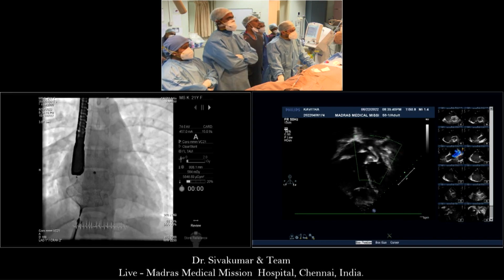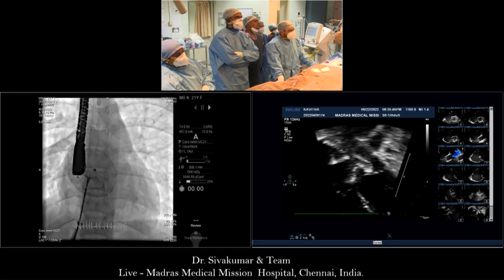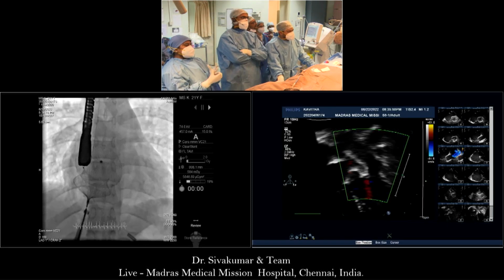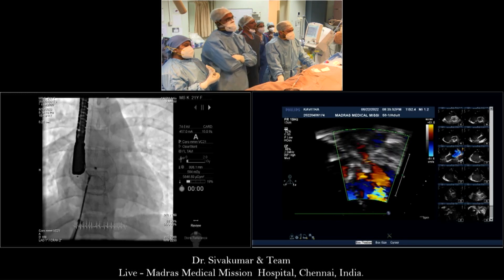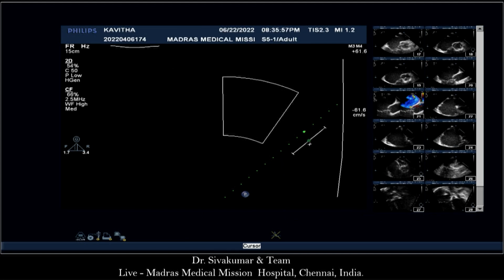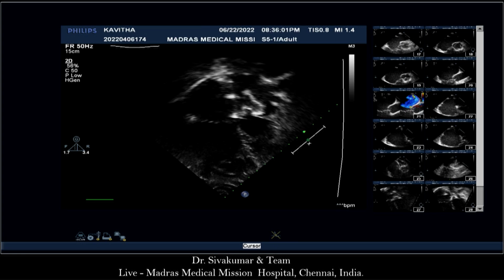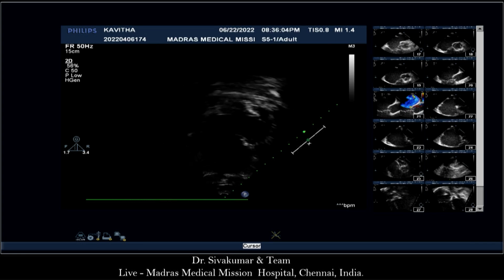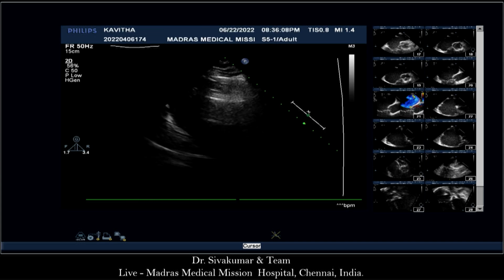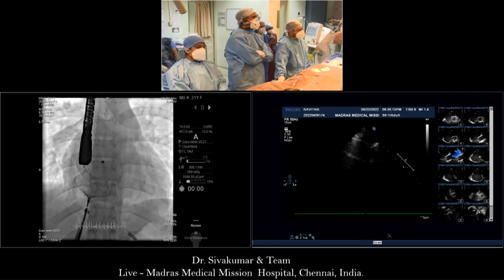Srija is now magnifying the mitral valve, and you just see the leaflet, and look at the color. Put the color. It all looks nice. There is some tricuspid regurgitation on this side, which probably was there before. It's a really good case for teaching, and I think we've got a hefty load of discussion in the audience, but in the end, you are the operator and we'll support what you want to do, because we're not in the room with you.